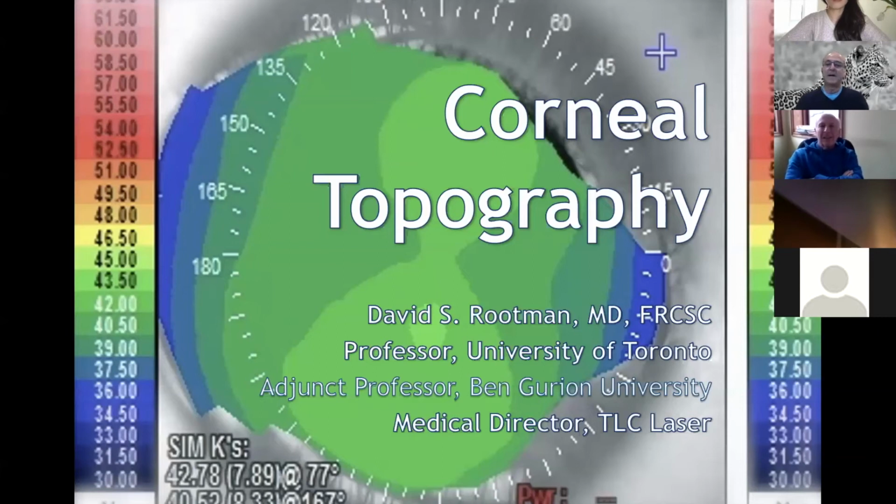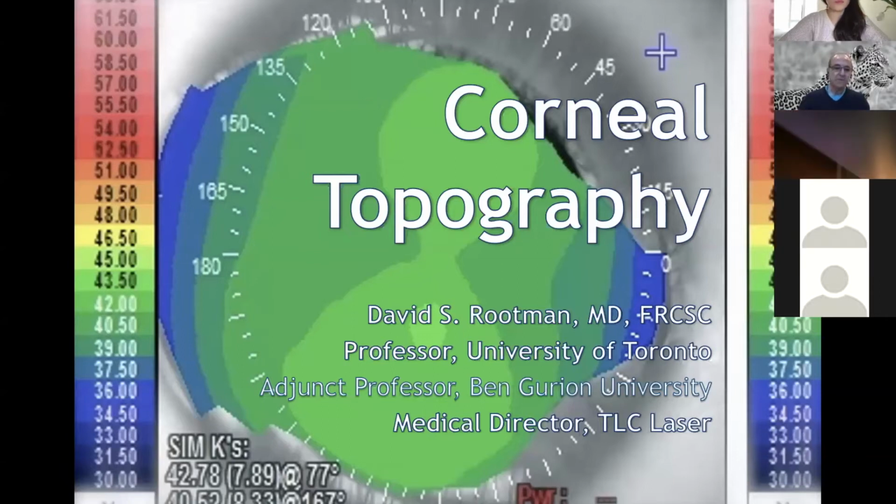All right. Anyhow, let's get started on this. This is going to be a very basic topography lecture, and we'll go through some of the principles and so forth that are involved with topography.